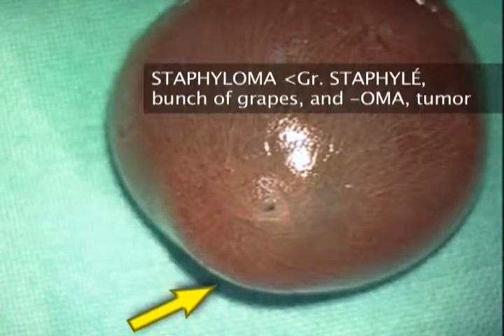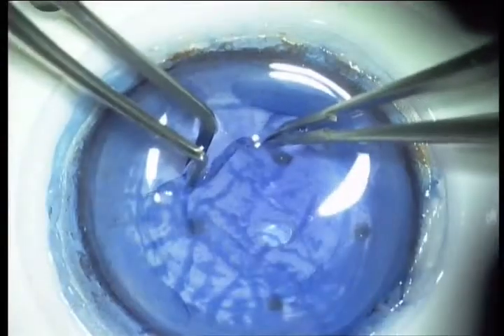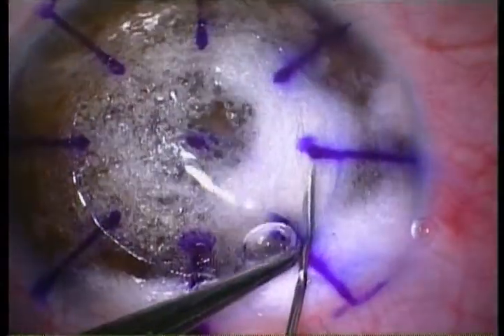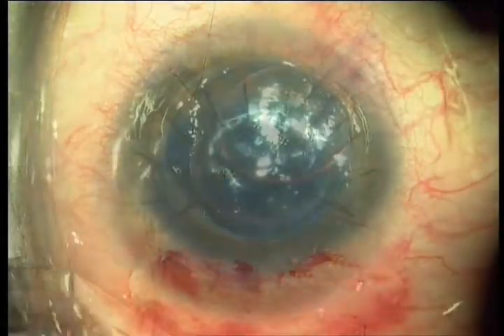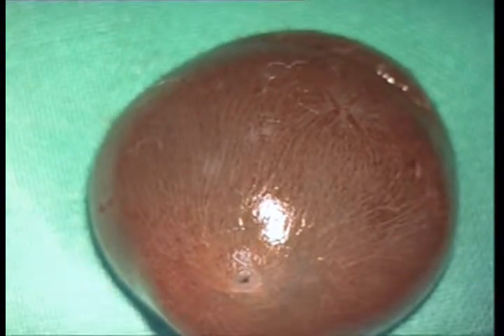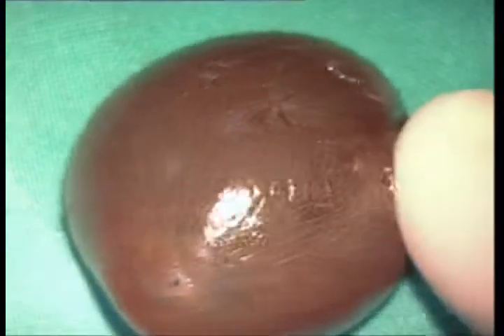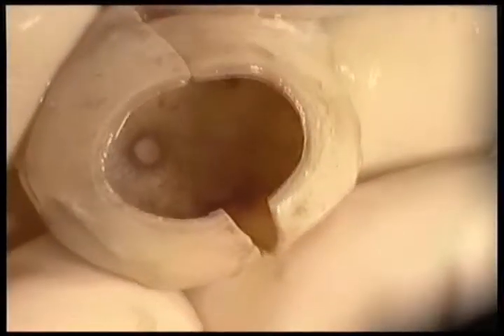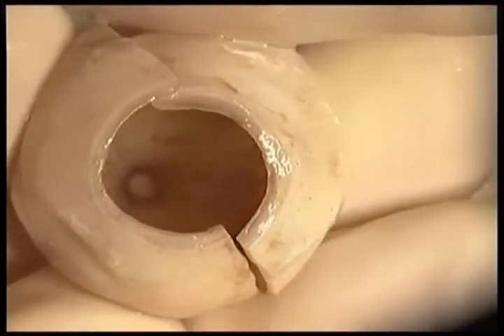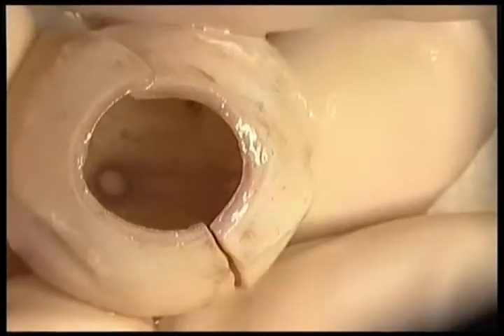The increasing number of techniques for scleral and corneal tissue transplantation demands accuracy in the obtention procedure. An anatomical approach based on choroidal extrusion in order to obtain the scleral and sclerocorneal tissue will be described. This surgical procedure allows the delimitation of sclera, choroid, and retina, and can play an important role in academic teaching and surgical training.